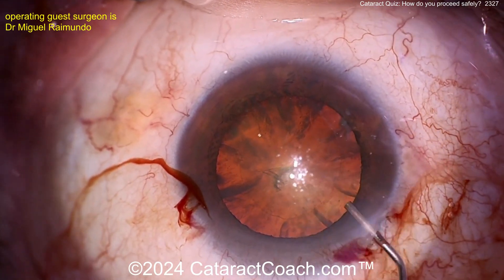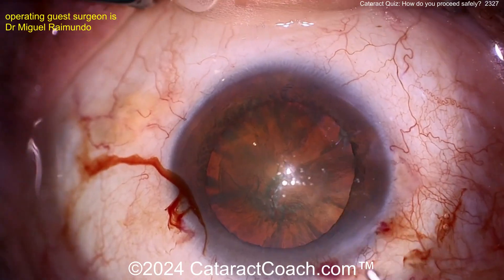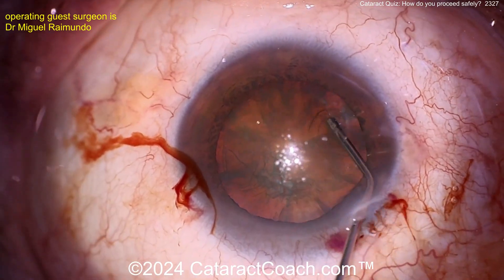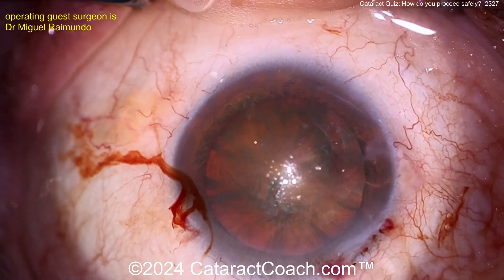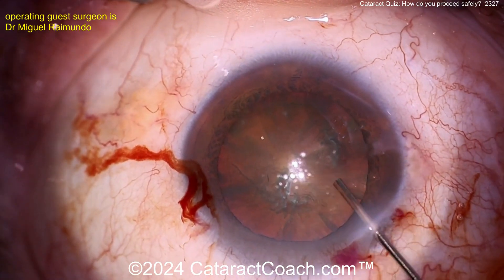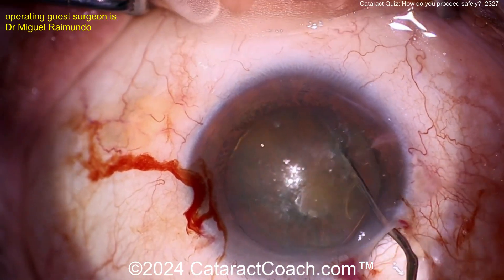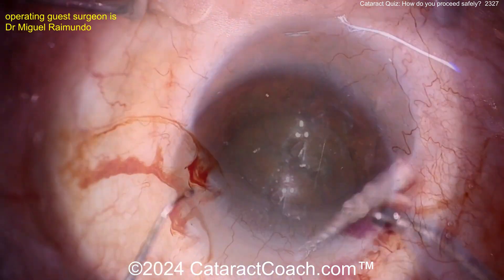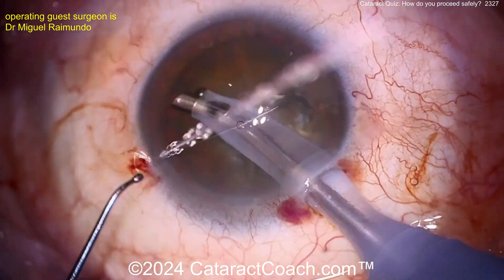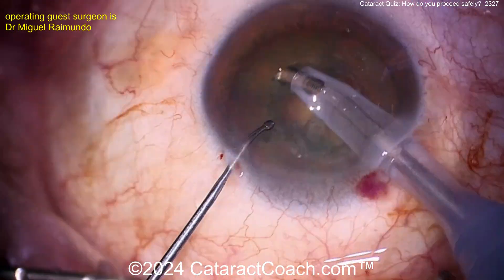For lens removal, you want to do some hydrodissection, but don't be too aggressive — otherwise you'll split the capsule wide open and that nucleus will sit very happily on the macula, and you don't want that. Nice and easy: gentle, small aliquots. I want this lens out of the capsule bag.